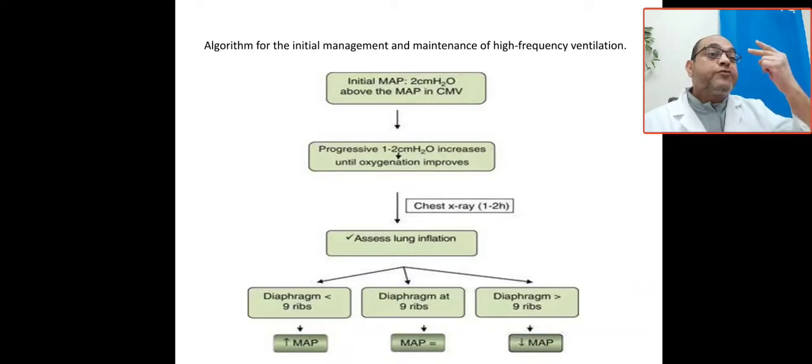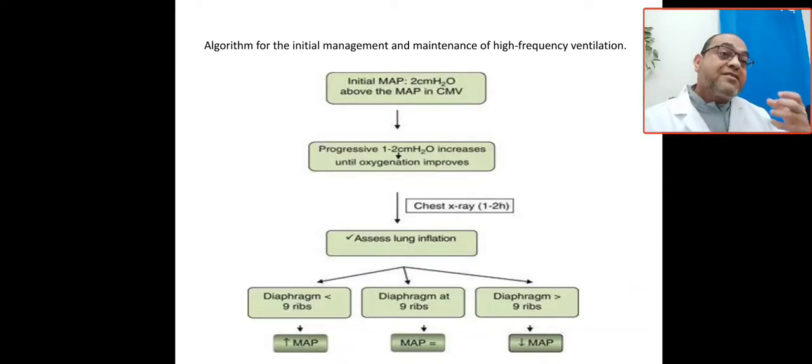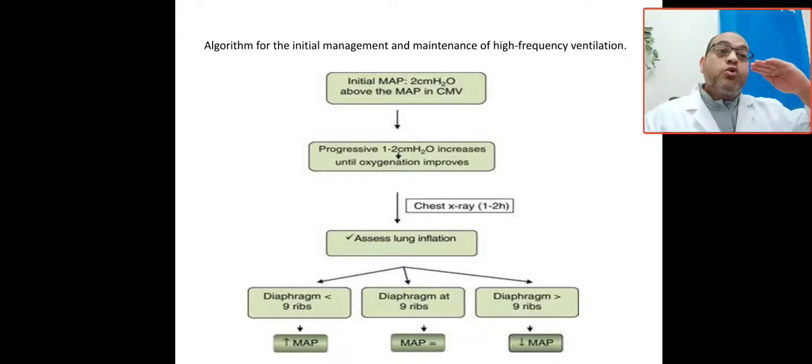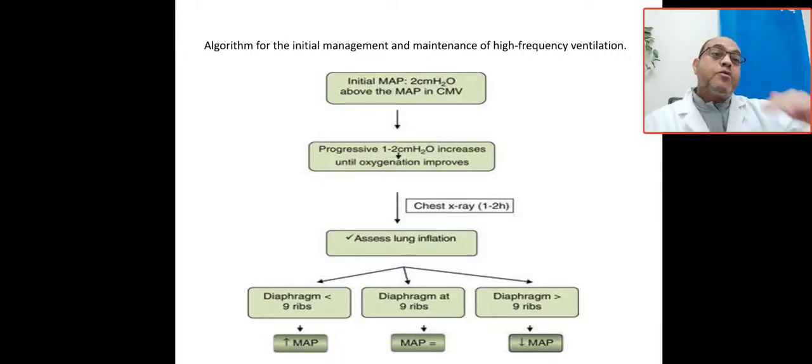Atelectasis. So you have two strategies to protect the lung from ventilator-associated injury, because the pressure is constant, the MAP is constant, so it will prevent atelectrauma, volutrauma and barotrauma. And also high MAP, because you are increasing 2 from the conventional, to keep the lungs open or to achieve lung recruitment and for open lung strategy.